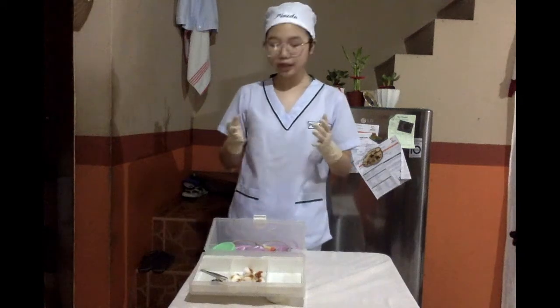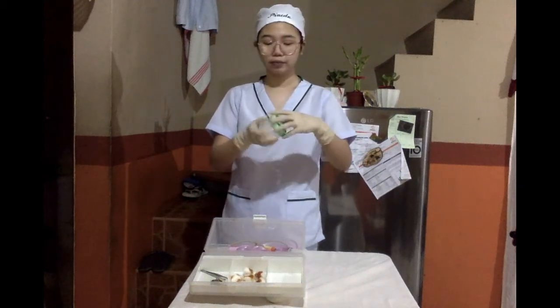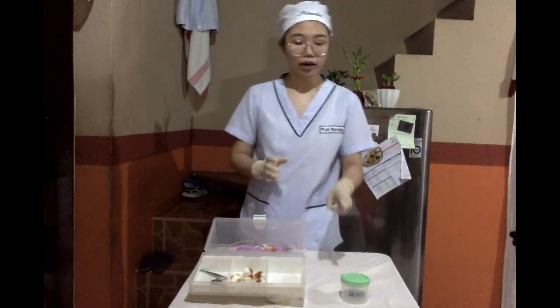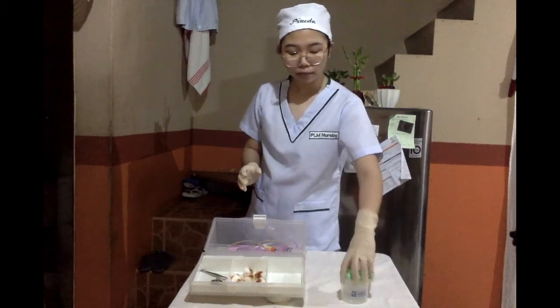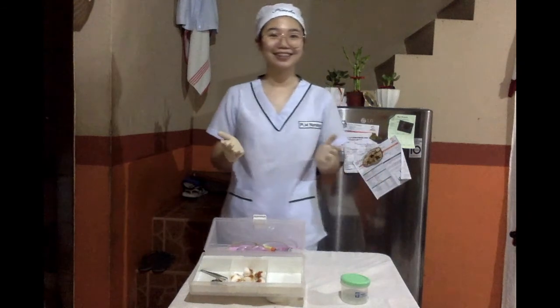I will now open the specimen collection container and place it on the sterile field. This is to ensure that the container is within reach for specimen collection. However, I do not like to fully uncover the lid, just like this, to prevent contamination from the air. So just put it like that.